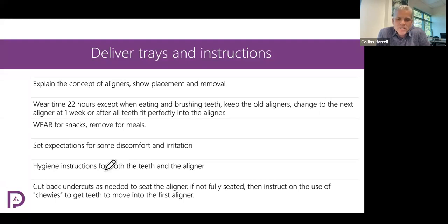But they might get a little bit of irritation on the inside of their lips. The teeth might get a little uncomfortable. The gums might get a little bit uncomfortable as these pressures are being applied. And they might need to take some ibuprofen or Tylenol just until they get used to the aligner wear. They might find that they salivate a little bit more, that they have to read a book out loud or something to get used to speaking around these aligners. That's pretty normal for starting an aligner case.